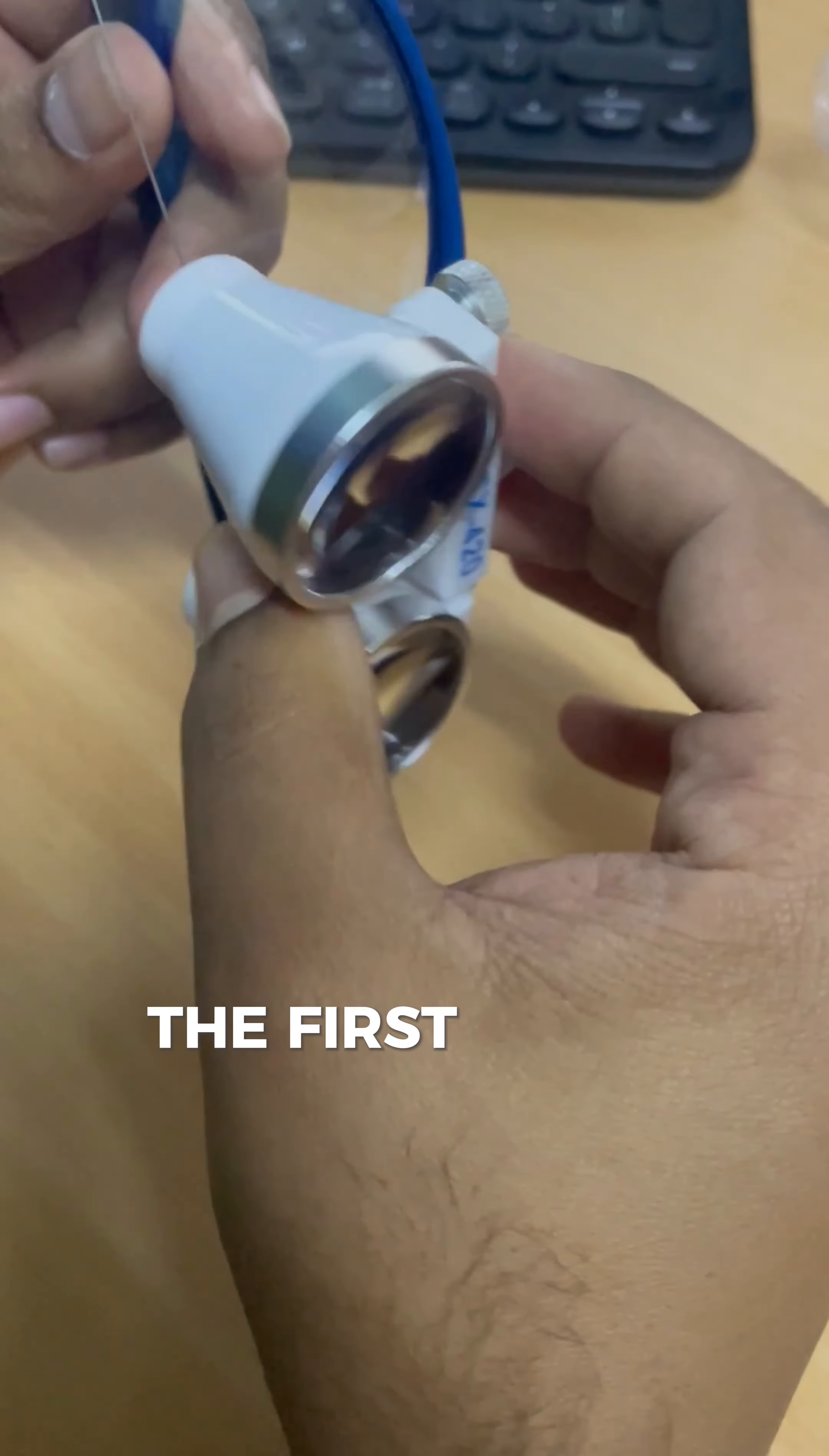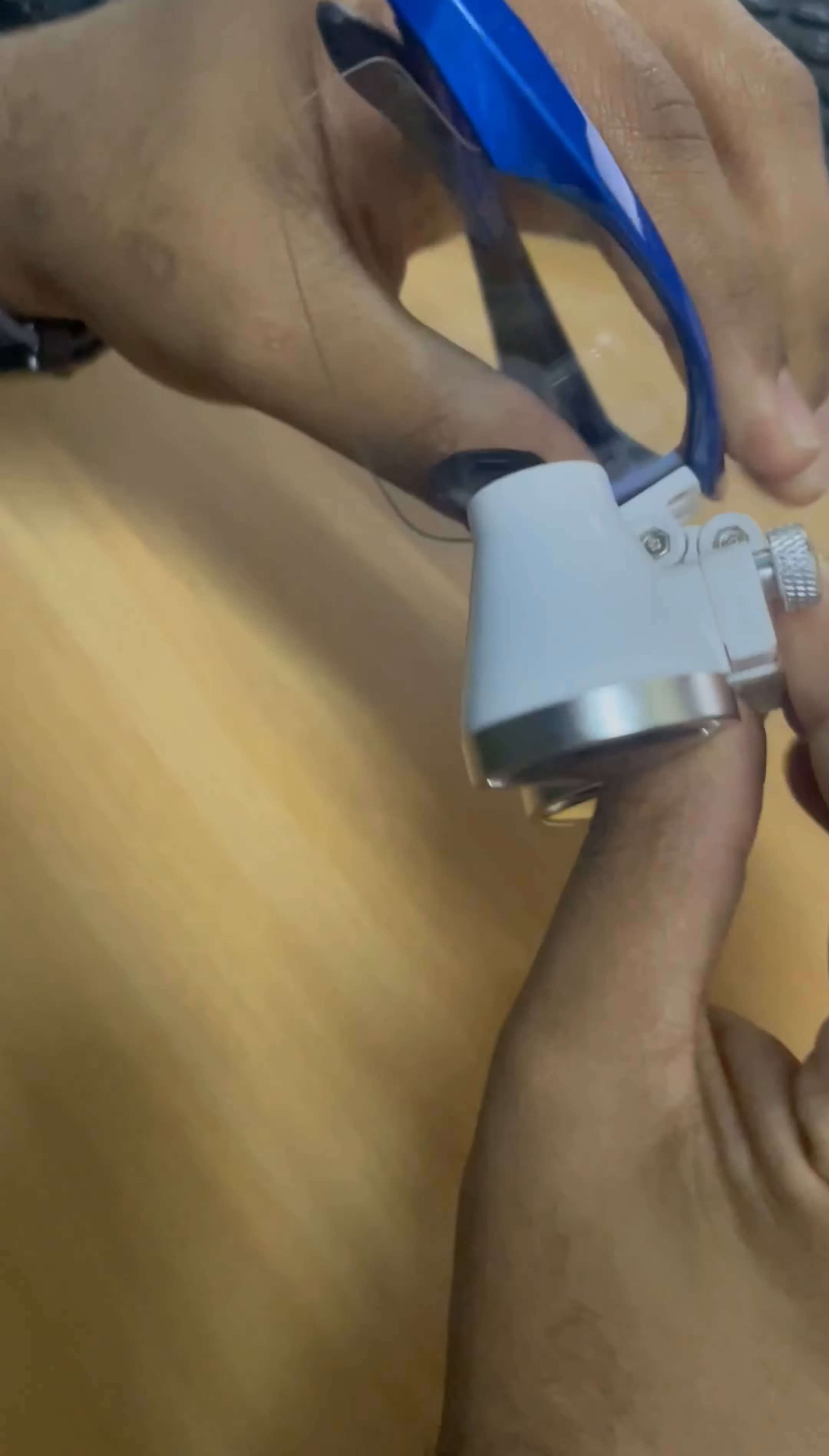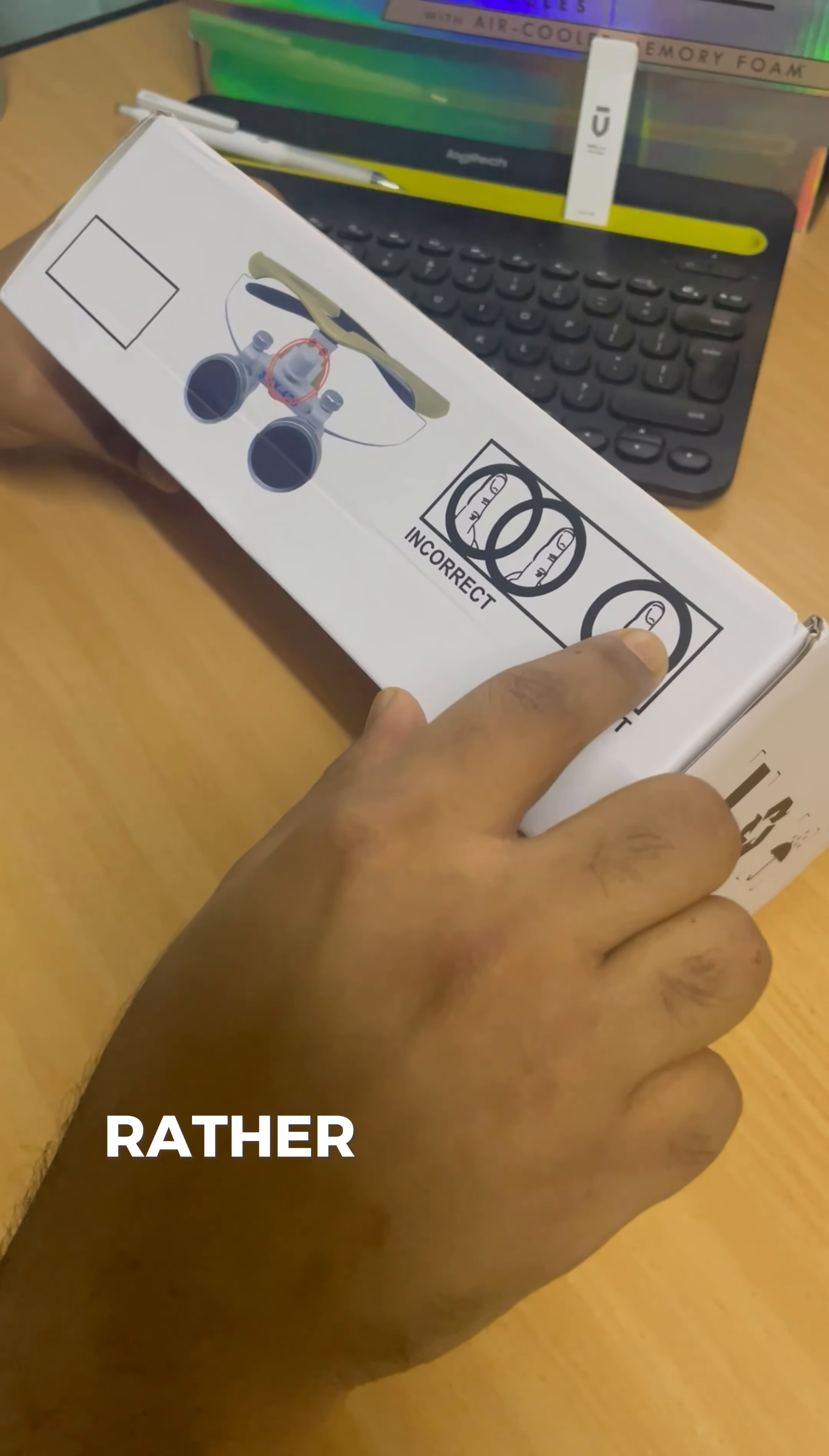The first thing you will want to do is adjust the loupes to fit your vision perfectly. You can move them up and down to align the lenses correctly, adjust the focal point, and match your interpupillary distance, ensuring you see a single clear image rather than two.